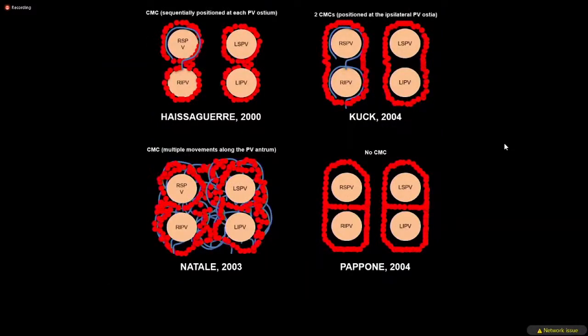Now, let's move on. This is how this evolved from pulmonary vein, and Brad mentioned from ostial to antral. Still today, the definition of antral is different. So in our lab, since the early 2000s, antrum has always been the posterior wall for different reasons that include imaging, embryology, and anatomy.